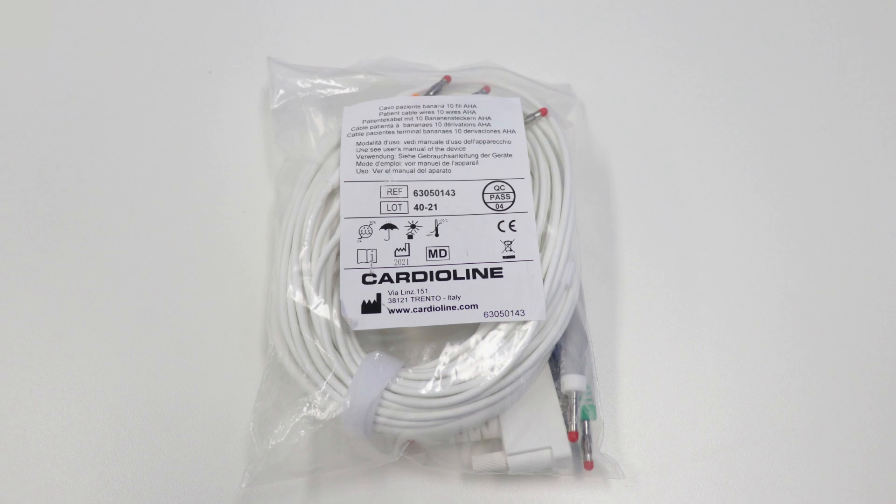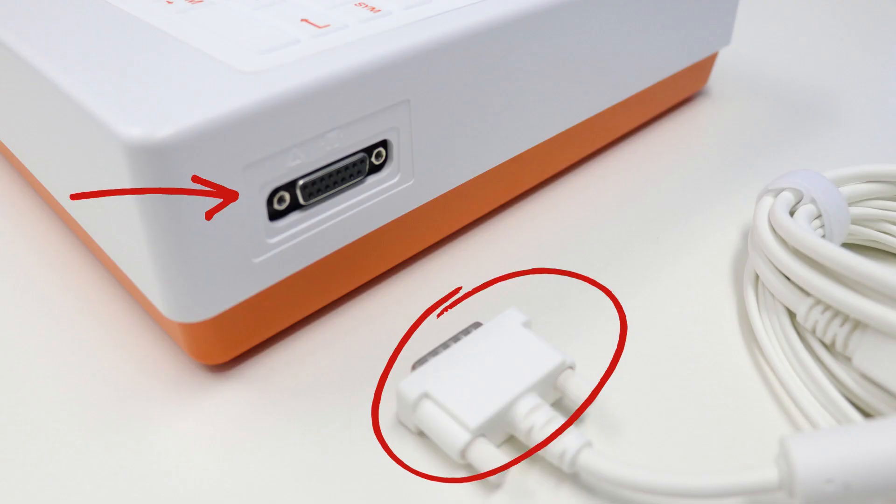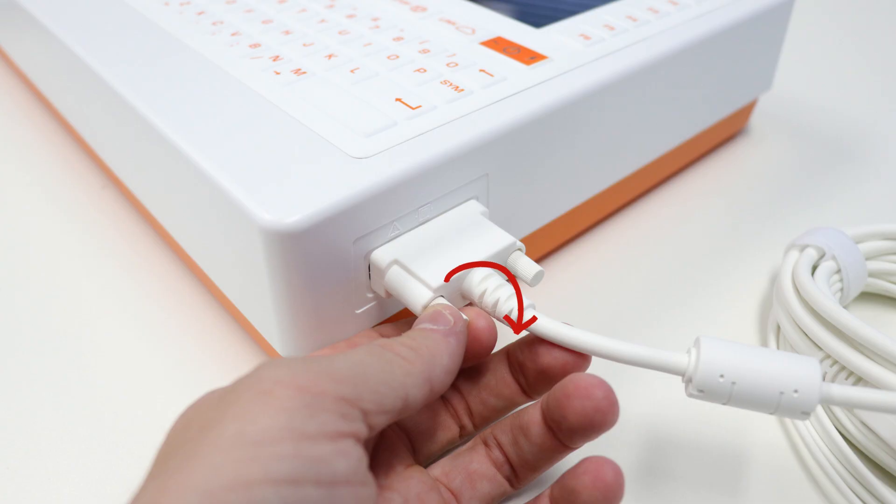Let's connect the ECG cables. Remove the cables from the packet — located on the right-hand side of the device is the ECG cable plug. Insert the plug into the cable connector socket and then spin the screws clockwise to fasten the cables to the device.